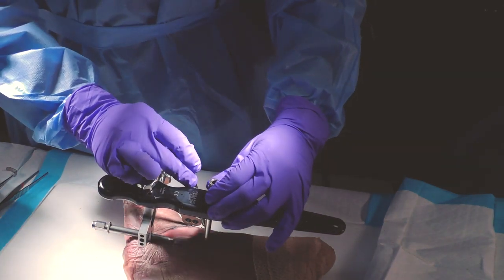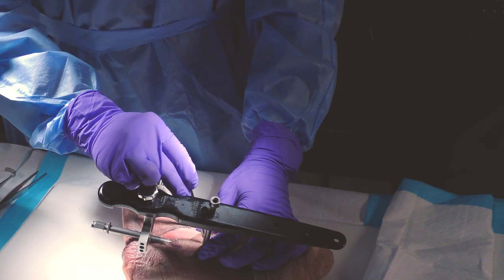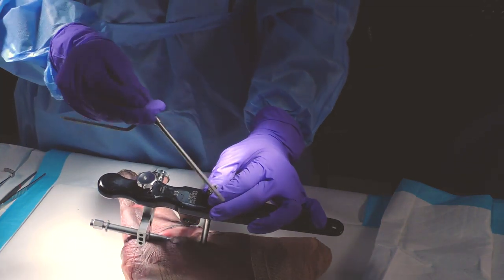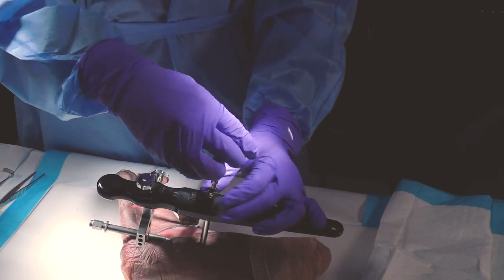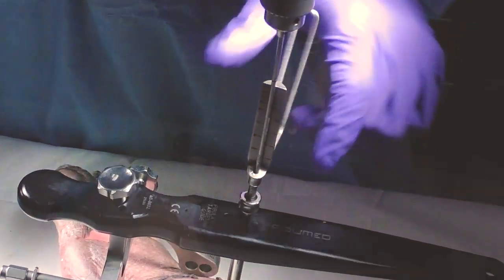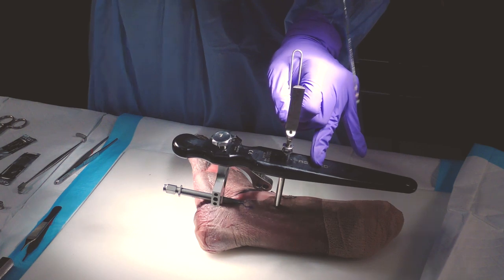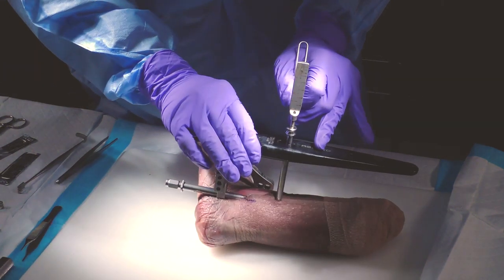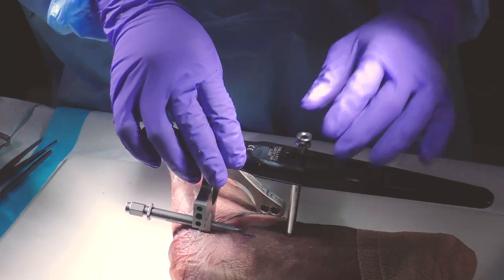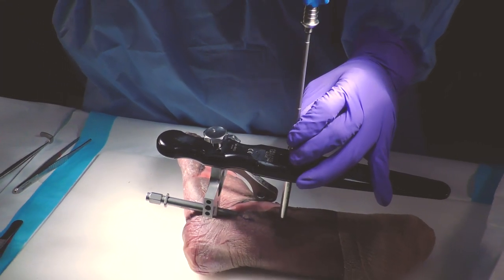We'll use the proximal locking — you can use either one or both. As you see, these are stab incisions, so they are minimally invasive. We again put the protection sleeve. This is the measuring device — when you have a feeling of how deep you're going, you can measure directly using the laser mark. If the cortical bone is strong enough, you can measure in a very accurate way. When it's not too strong, like in this specimen, it's not so easy, so we'll estimate 22 millimeters. In order to achieve proximal fixation, you're going to go through the fibula and into the tibia.